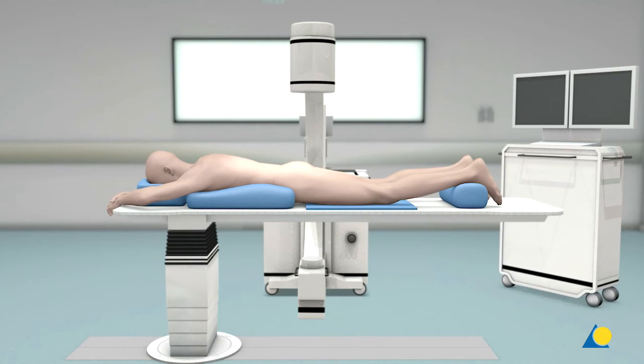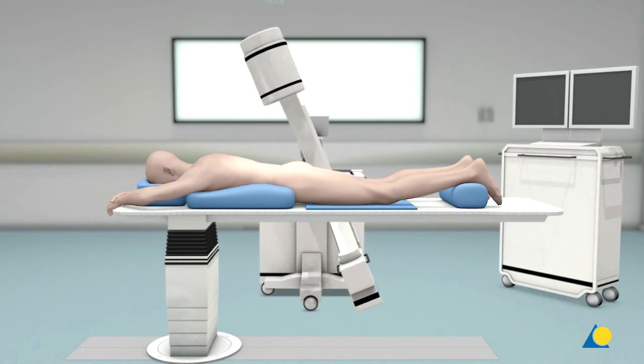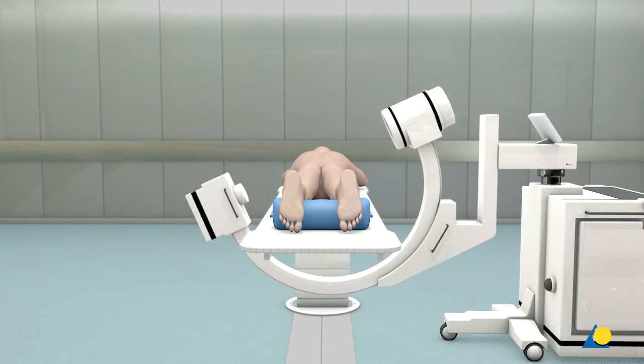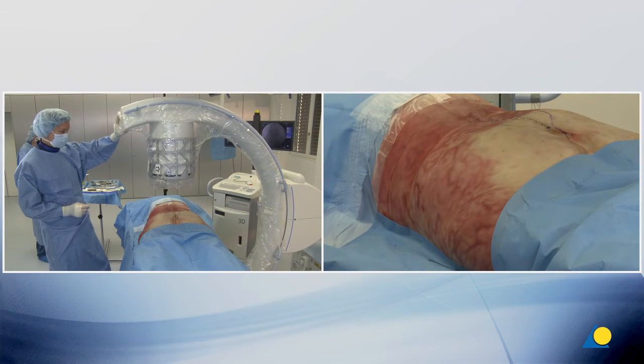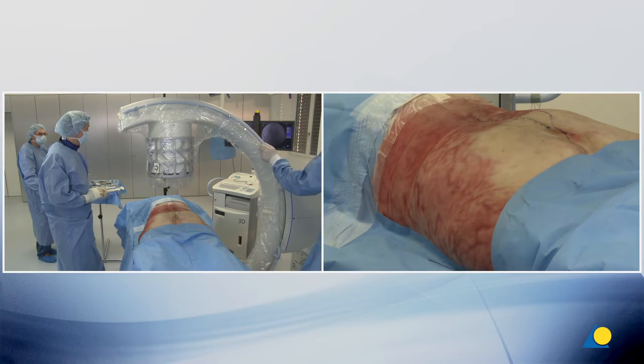The C-arm is brought into place and an AP, inlet, and outlet view must be visualized, as well as a lateral view of the sacrum. The involved leg may be free-draped if traction and manipulation are expected. The sterile draped C-arm is brought in from the uninjured side and placed in the outlet position.